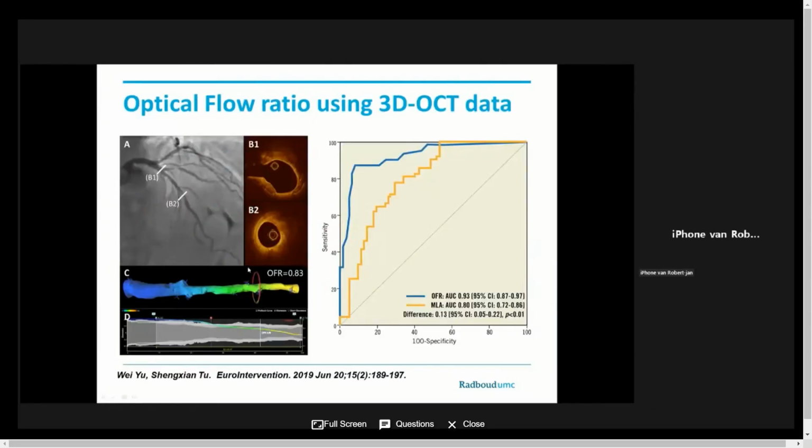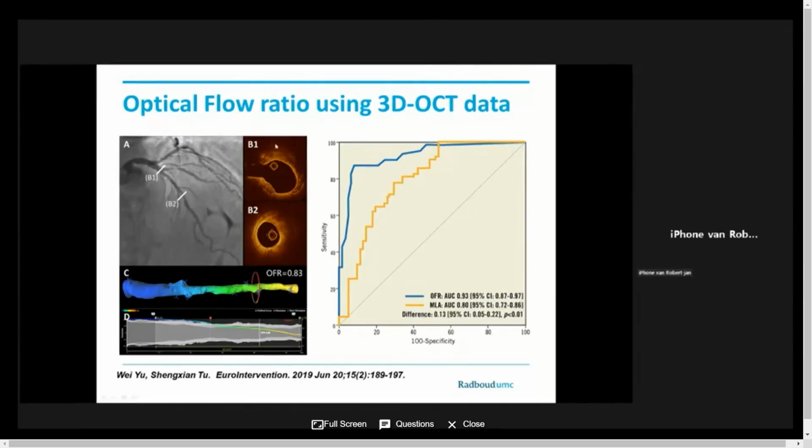But if you really work on this technology, and you have seen this, if you have all the 3D slices of the OCT, you can easily calculate, of course, using similar kinds of heart flow modeling techniques, predict what the pressure drop established from different kinds of flow situations for this vessel could be, with a proximal reference area, an MLA in between, but also multiple lesions in sequence.